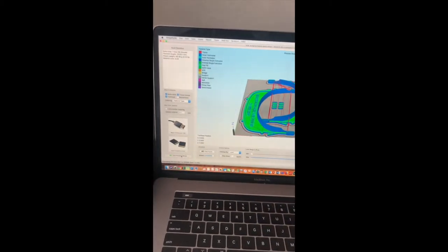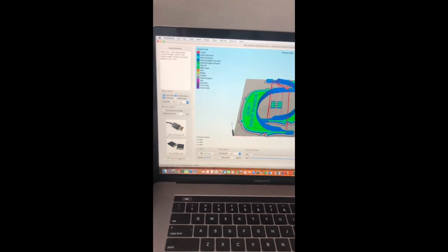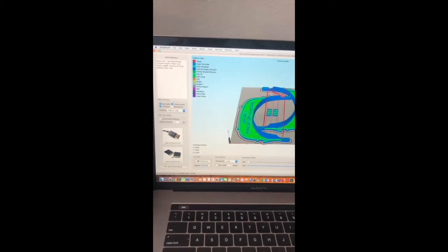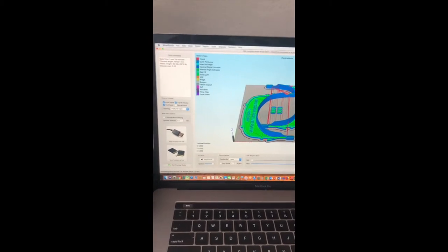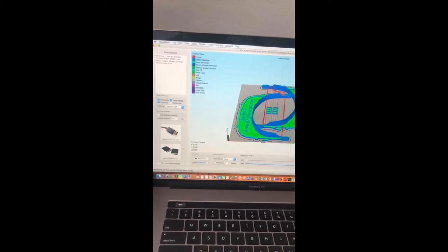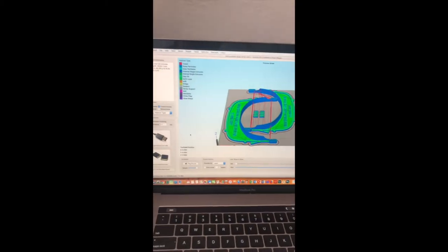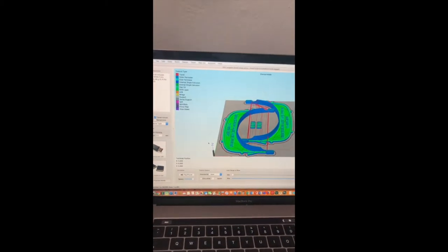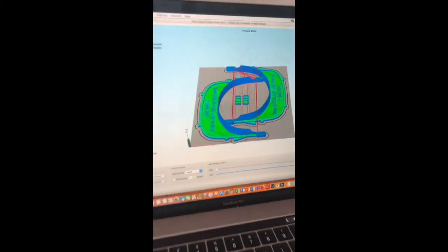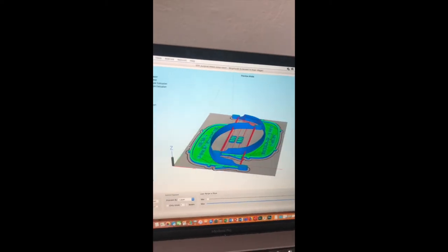The file that I originally downloaded was a 3D model — that file type was an STL file. Now, once I've run it through this program and applied my process, or recipe if you will, it becomes a new sort of file: it is now a G-code file. That is a format that the machine can understand. It's essentially a bunch of code — step-by-step instructions that the machine can follow in order to create the geometries you see here using the settings I've specified.